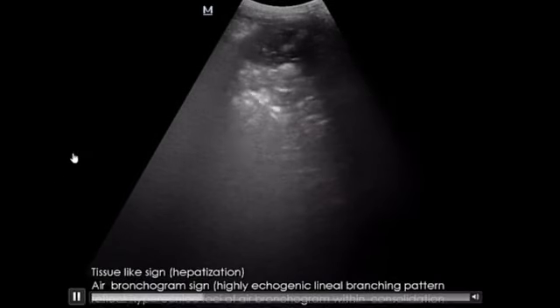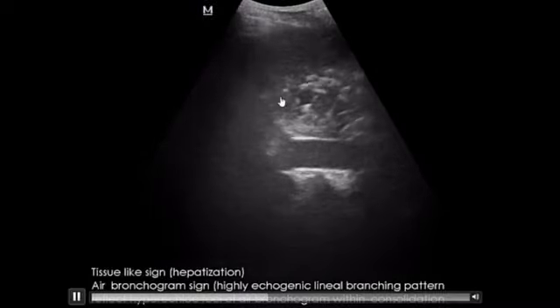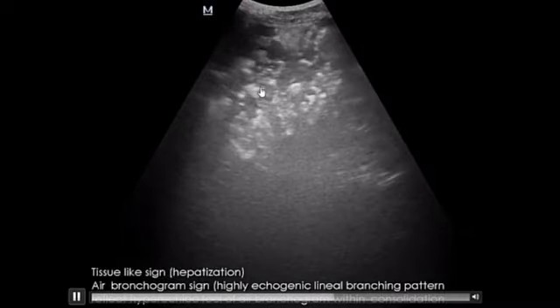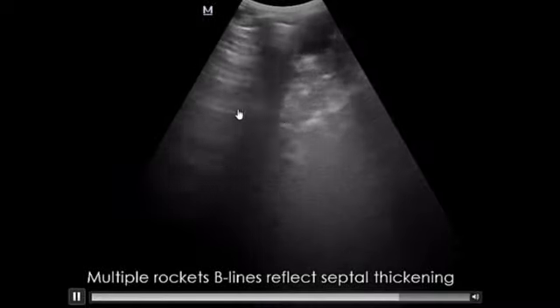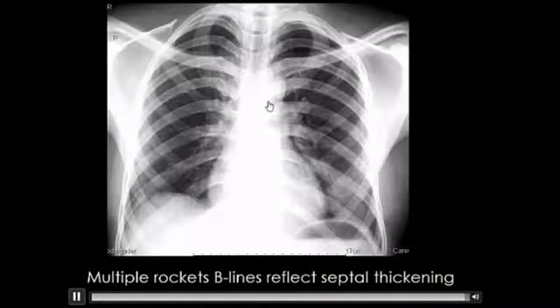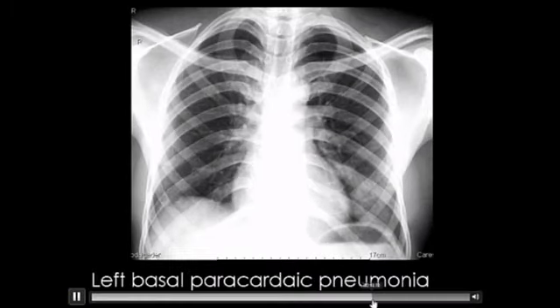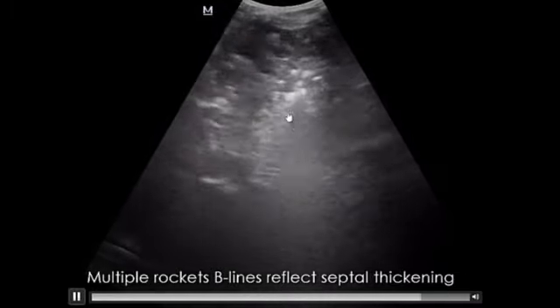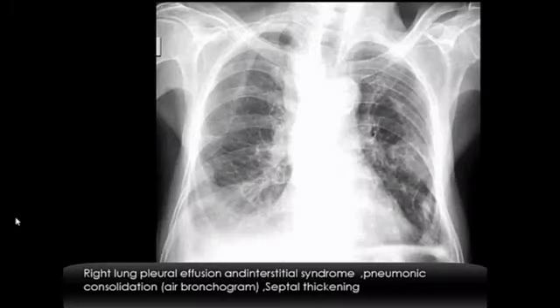We find hepatization or tissue-like consolidation, with multiple movements of white lines. This is the air bronchogram, moving according to the respiratory cycle, with multiple rockets or B-lines. We find vertical lines also present; these are multiple B-lines.